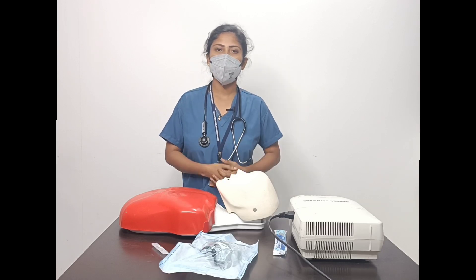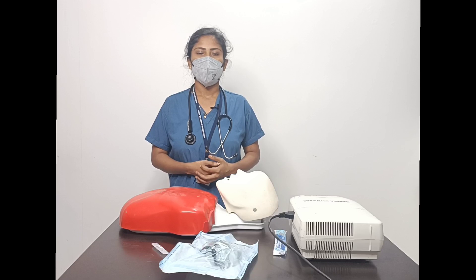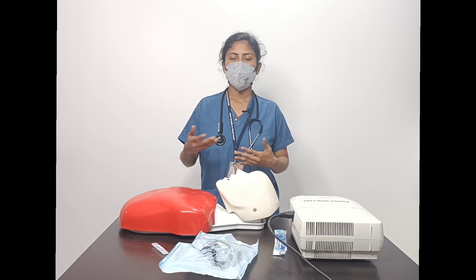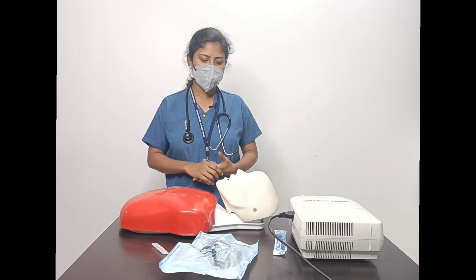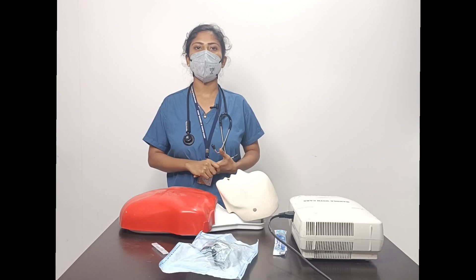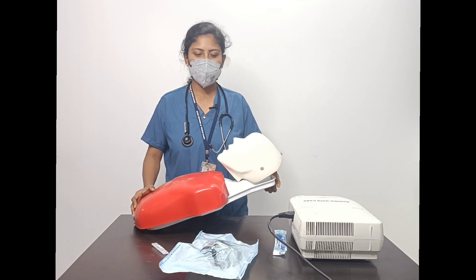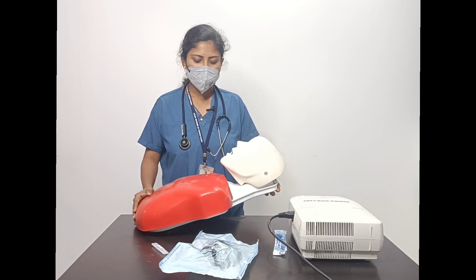Before giving any procedure, we have to explain everything to the patient — what we are doing, the advantages, and the disadvantages — and we must obtain consent. We also need to reduce the patient's anxiety. Positioning is very important; we have to position the patient in a semi-Fowler's position at 45 degrees.